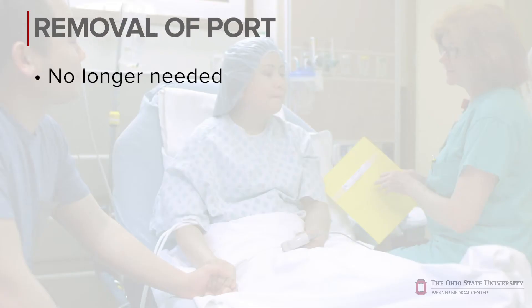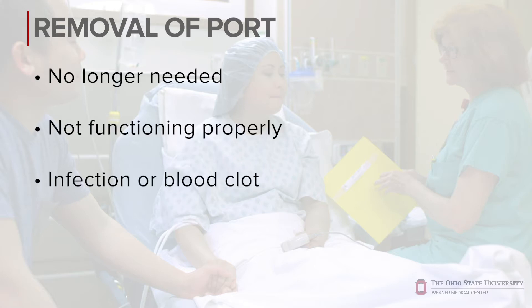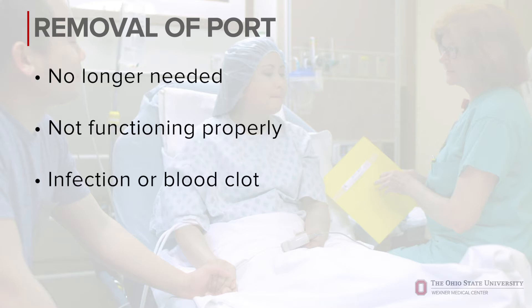A port is a device used to provide IV access for medication or other treatments, and it consists of a chamber connected to a catheter or tube that goes through a vein in the chest. We remove the port when it's no longer needed, if it's not functioning properly, or in the setting of infection or a blood clot, for example.